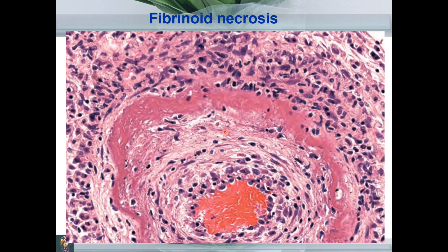This slide shows arterial tissue. You can see a prominent pink rim in the histological section. This pink deposition is the hallmark for fibrinoid necrosis. Again, there is loss of cellular and nuclear details along with deposition of inflammatory infiltrate, and this pink-colored tissue is indicative of fibrinoid necrosis.